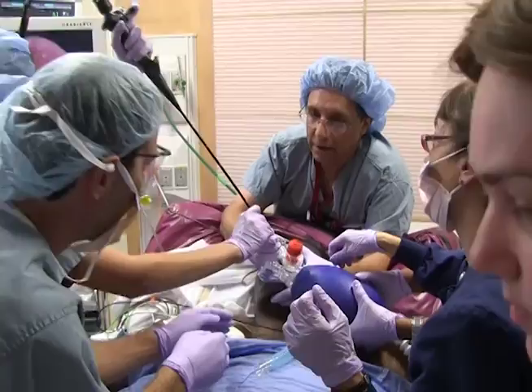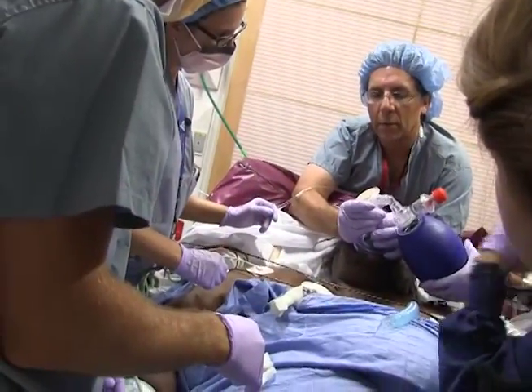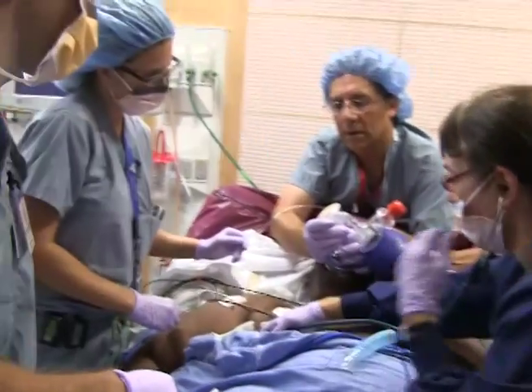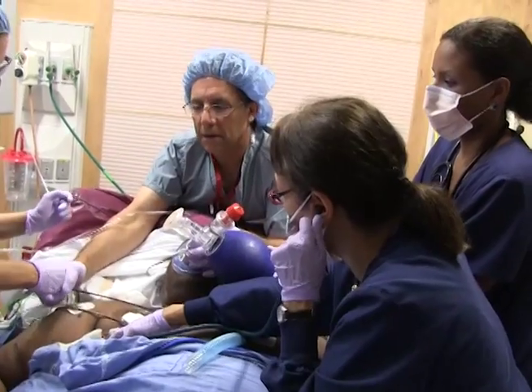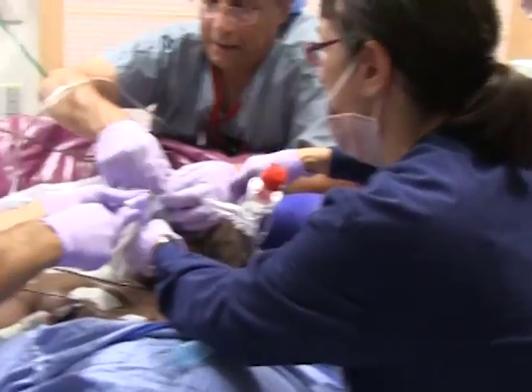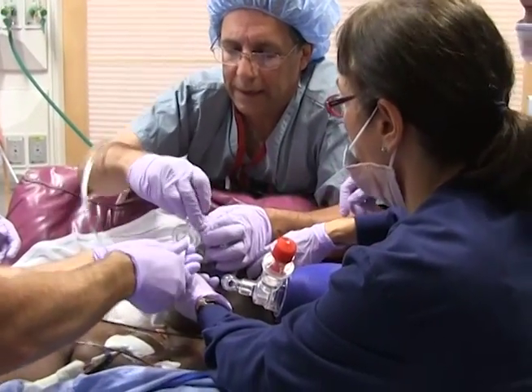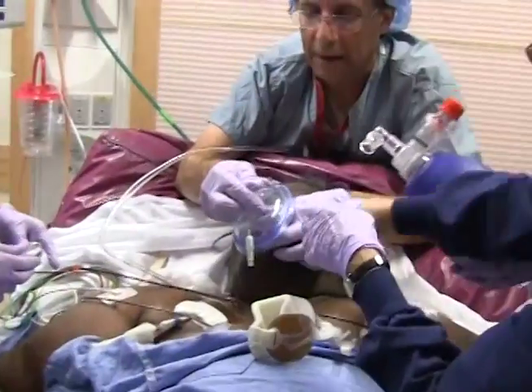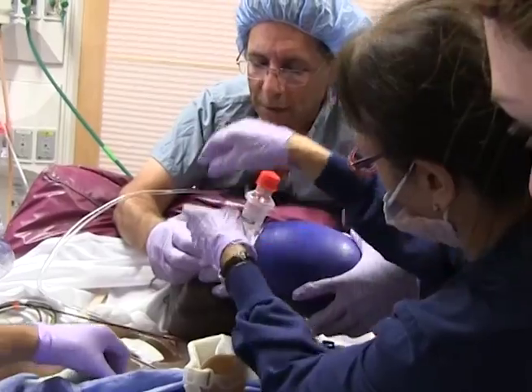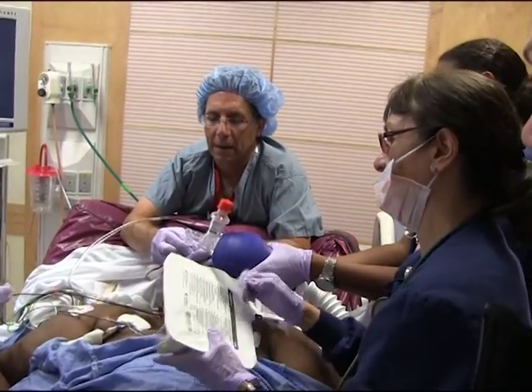The flexible intubation scope has been removed and tracheal intubation verified with the use of an EasyCap2 chemical end-tidal CO2 detector. The diaphragm is now removed. And the endoscopy mask is removed, and the tracheal tube is fixed in position.